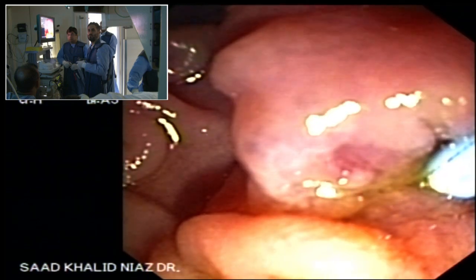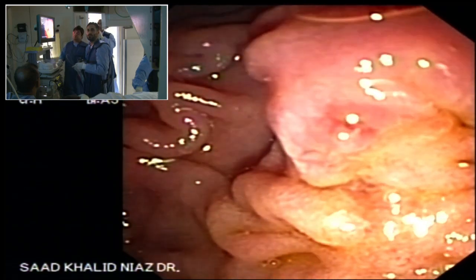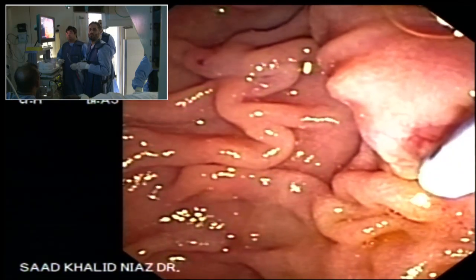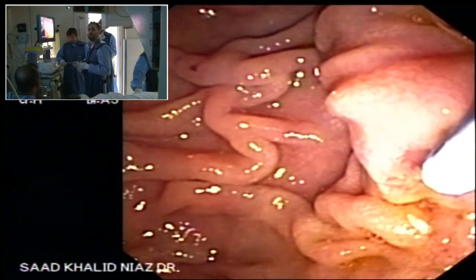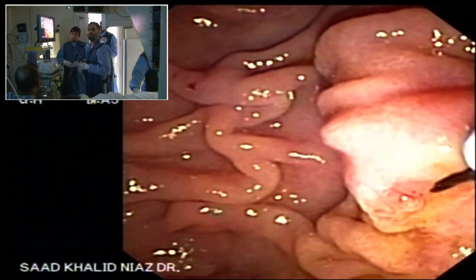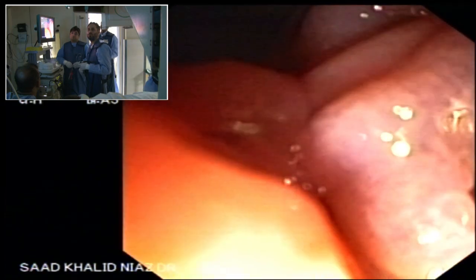ठीक है, हाँ अब ज़रा सा उसको, हाँ दूर, हाँ ठीक है। हाँ थोड़ा सा ऐसे, या अप डाउन में, हाँ व्हील यूज़ करें जिससे आपको ज़रा सा डिस्टेंस मिले। हाँ, अब वायर थोड़ा सा एडवांस करें, हाँ ठीक है ठीक है, अब एंगेज करें इसको, हाँ शाबाश। इट्स अ बिट लो, लेकिन, and you can still cannulate.